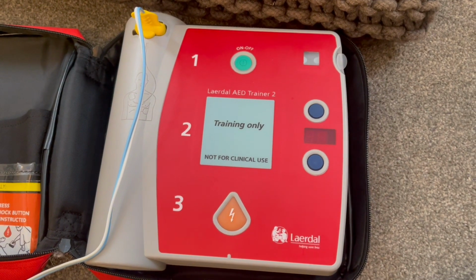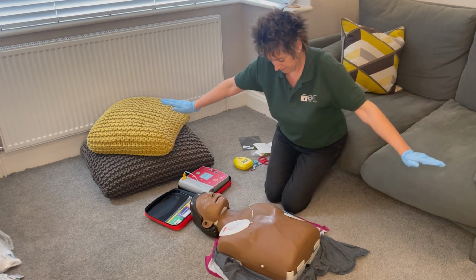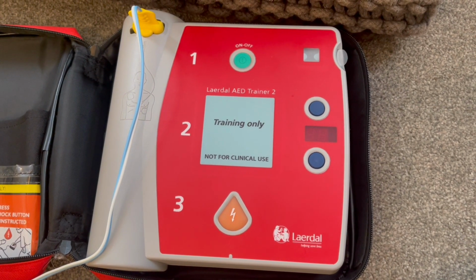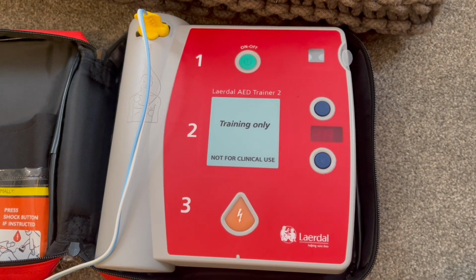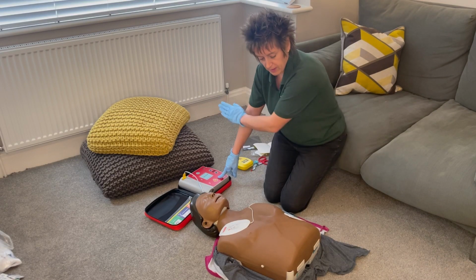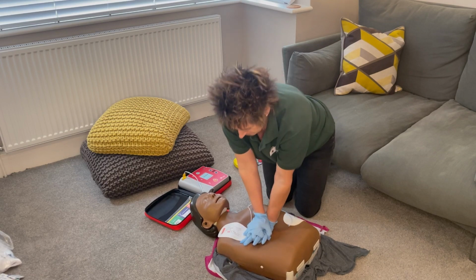Analyzing heart rhythm. Do not touch the patient. Making sure that everyone is standing back, nobody's touching a casualty, because if someone is touching them, reading will be incorrect. It will analyse your reading rather than the casualty's reading. Now remember, it's looking for a shockable rhythm. Shock advised. Charging. Stay clear of patient. Tell everyone to stay back, so I say clear. Deliver shock now. Press the orange button now. Shock delivered. Start CPR.